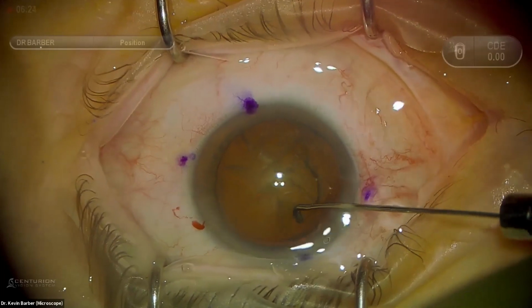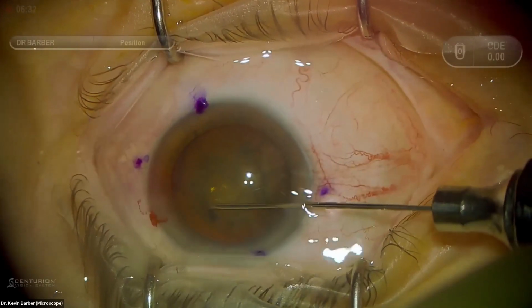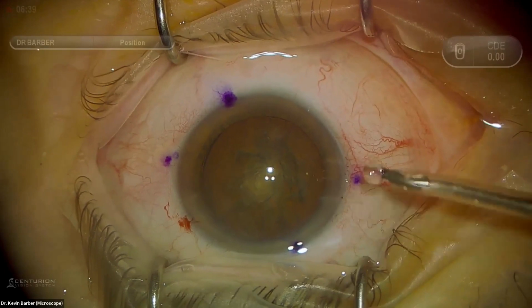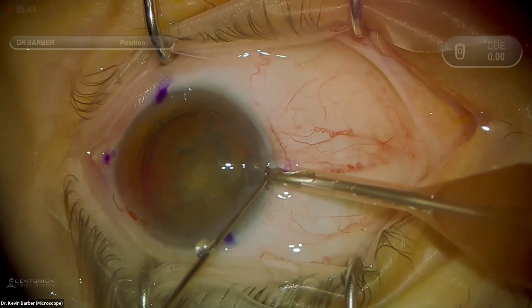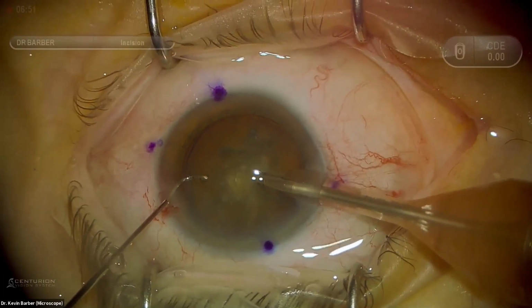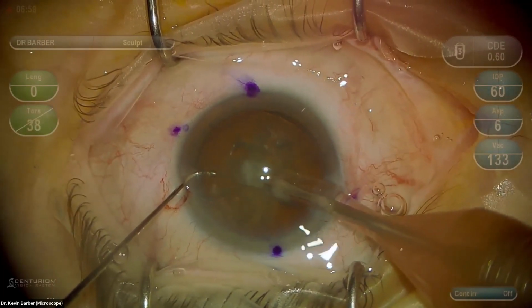You can see the golden ring here as I hydrodissect with a little hydrodelineation here. The lens now is really rotating. I like to open my incision with my second instrument as I bring my phaco needle in, just to prevent a Descemet's detachment that can happen right there at the internal lip of the incision.